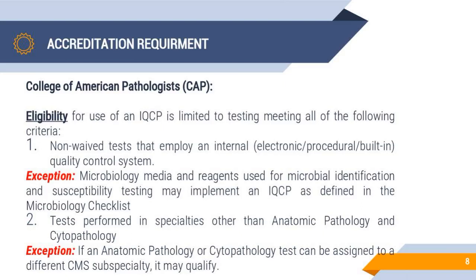Many questions before came to me from micro people: when should we do IQCP because we have some minimum or less than the QC requirements? To answer you, I have put in the last slide one of the references. It has a list of all the micro and non-waived tests which mandate the IQCP, or where it is optional, or which don't need IQCP. It's really a good reference. I encourage everybody to go get it and read it.